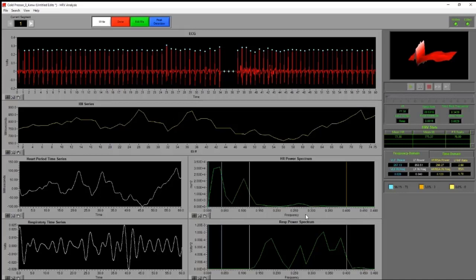Okay, so the question is revolving around, if you're collecting impedance data, does MindWare adjust the high frequency HRV and RMSSD values given respiration rate? It's the responsibility of the researcher to know that participants are breathing normally. Certainly, visualizing them during the experiment can ensure that they're not hypo or hyperventilating. But if we knew that we expected the respiration rate to be outside of the normal range because of the stress condition, we can certainly justify that by moving those bands around.